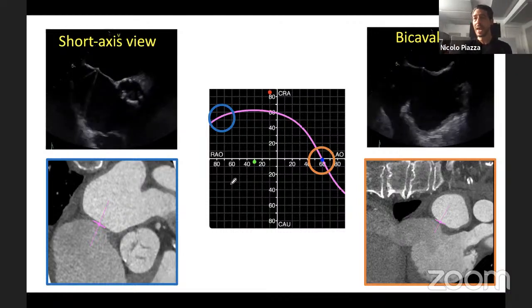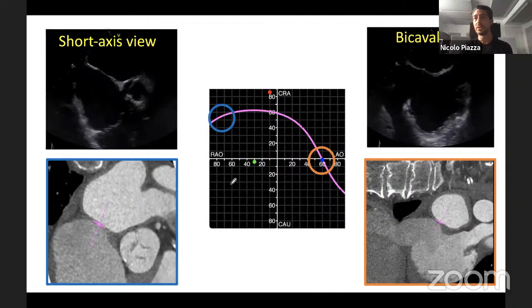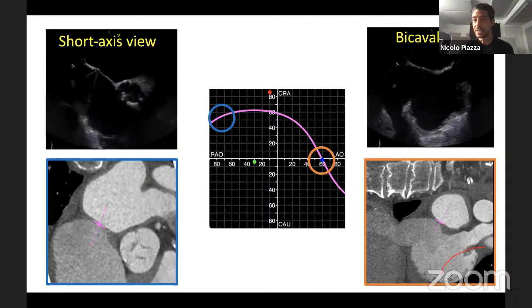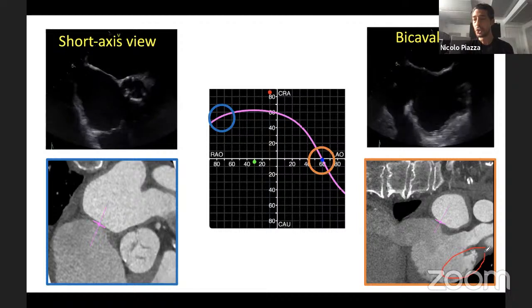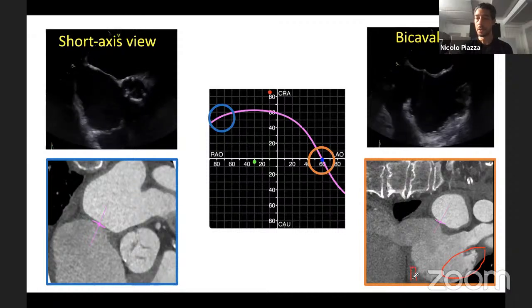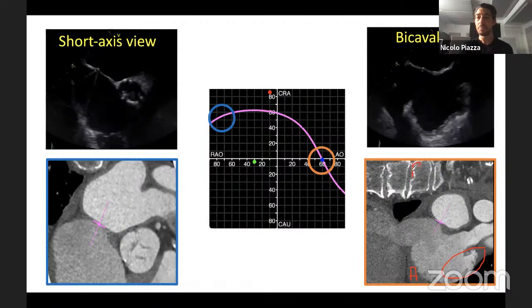But let's look at the echocardiographic image on the top right, and you see you have the corresponding CT image on the bottom right. Notice that you have in this area the right atrial appendage, which is anterior, right? We know the appendages are anterior structures, so that's anterior. And we have here the spine, and the spine must be posterior.